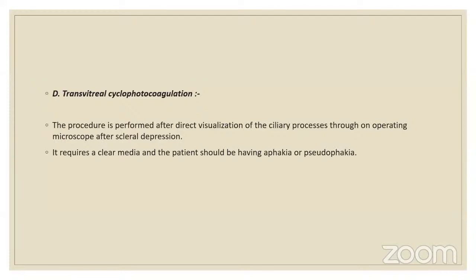The fourth is transvitreal cyclophotocoagulation. The procedure is performed after direct visualization of the ciliary process through an operating microscope after scleral depression. It requires clear media, and the patient should be aphakic or pseudophakic.